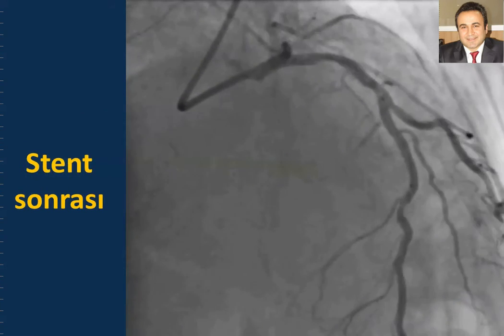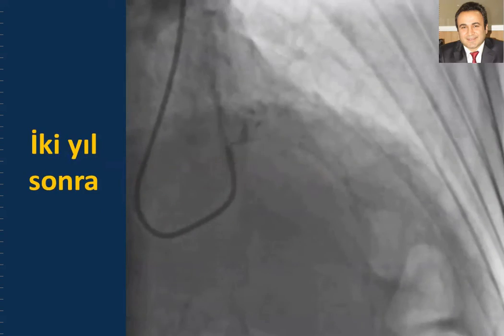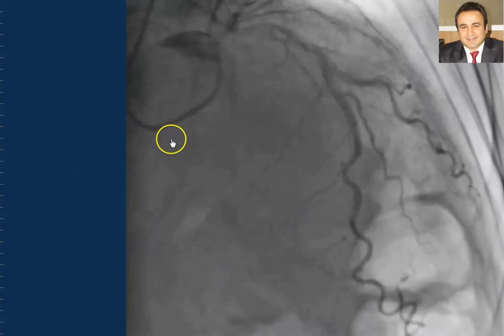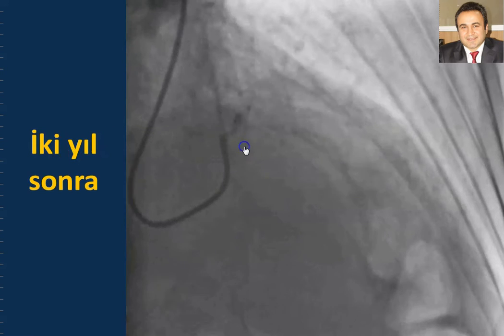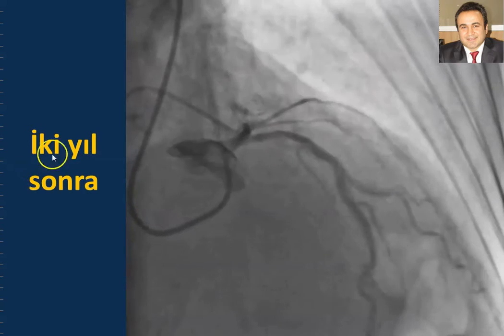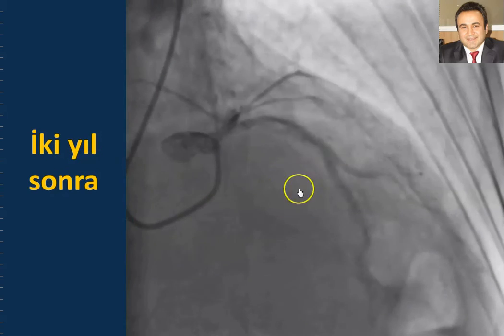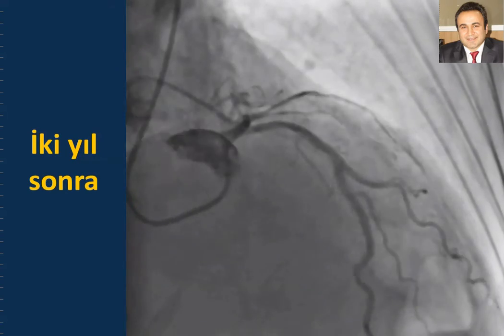After dilatation, this was a 2-year-later picture of the LAD. The stent was patent. There was no intimal hyperplasia or minimal intimal hyperplasia in this patient.